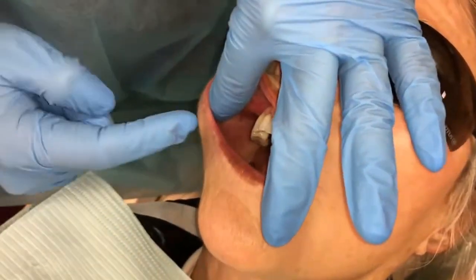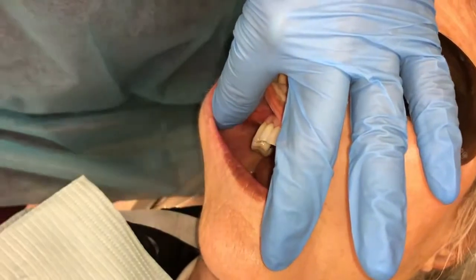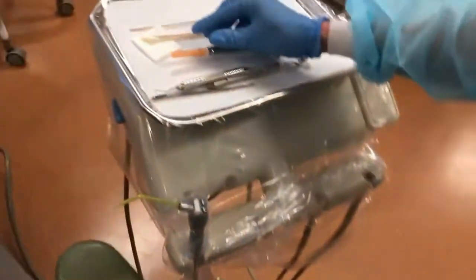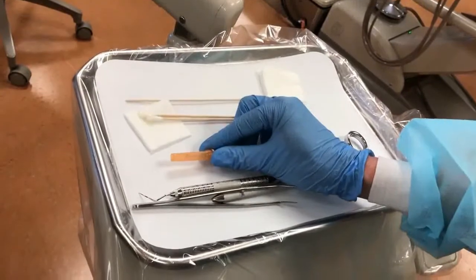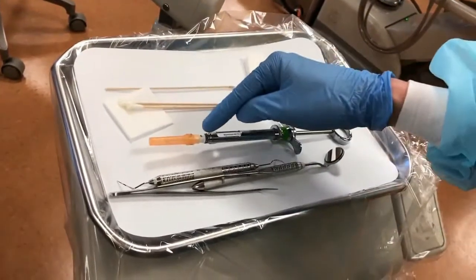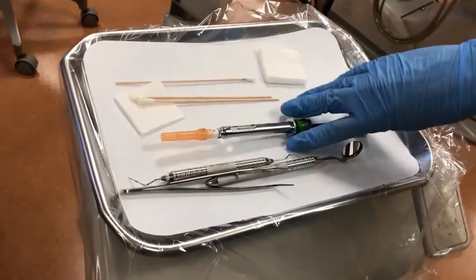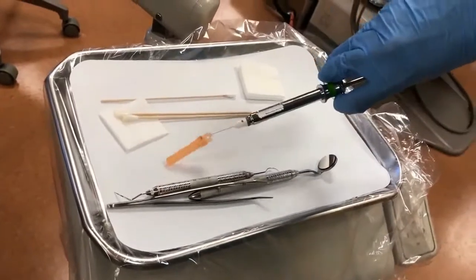Insert the needle between the central and lateral incisors. Push the needle to the target point. Make an aspiration test. Release an anesthetic. Remove the syringe needle from the soft tissues.